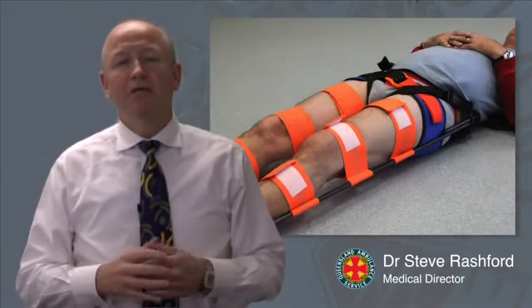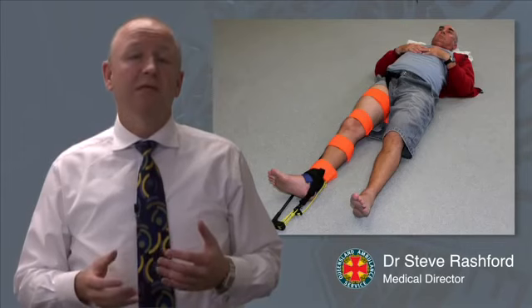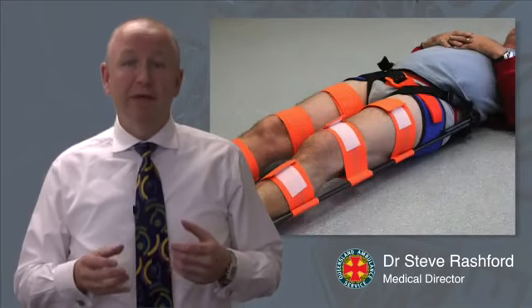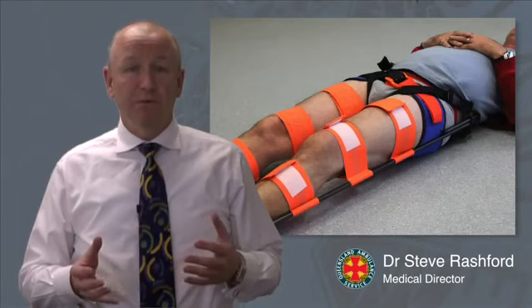It's important to recognise that the application of a traction splint to femoral fractures is a very important part of haemorrhage control and analgesia. These are a priority for patients who are suffering significant trauma and have a femoral fracture. We understand that a number of our patients potentially have a significant pelvic fracture as well as a femoral fracture. With the new CT6 splint, we can apply the pelvic binder firstly and then apply the CT6 traction splint to the femoral fracture as well.